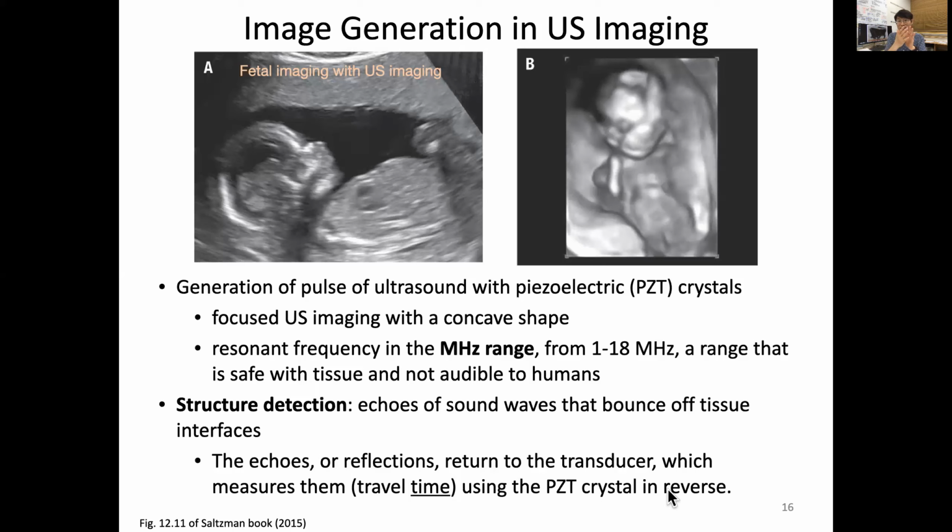When we generate sound, we give a voltage input to piezo to generate this pressure wave, while the reflected pressure now returns back to this transducer, and that PZT receiving this pressure generates a tiny voltage difference, and that we sense. So we use this as both actuator and sensor together. That's why I put it in reverse.